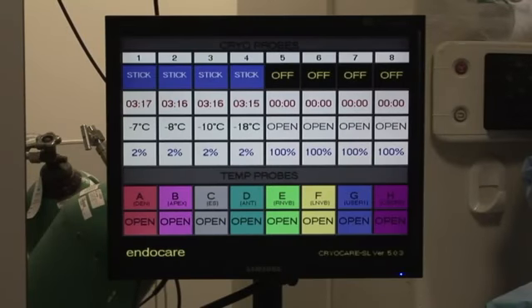That noise we just heard was the stick freeze activating one of the probes or two of the probes. Got down to -4 degrees, so the argon cycle is running again. There's two more. That's keeping them stuck in place. So during the thaw cycle, they won't shift at all. The thaw cycle, I think of, and I think it's conventional to think of it, about 80% of your freeze cycle. So if a 10-minute freeze cycle, an 8-minute thaw cycle is what we're going for here. And then the second freeze cycle follows.